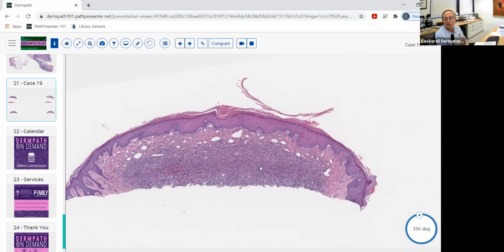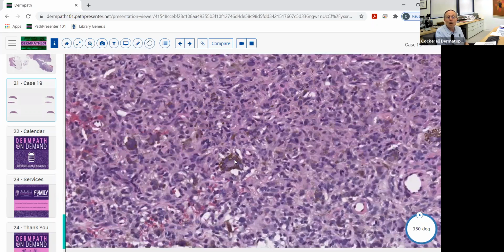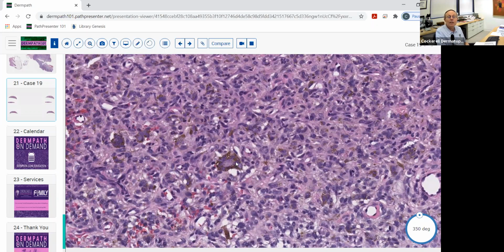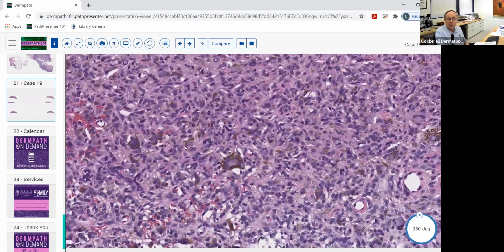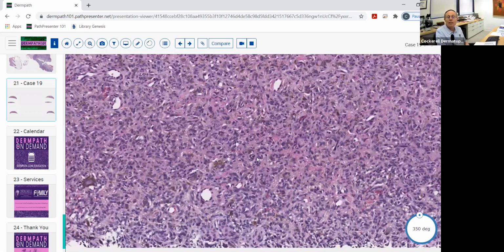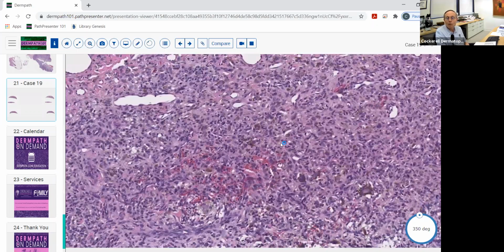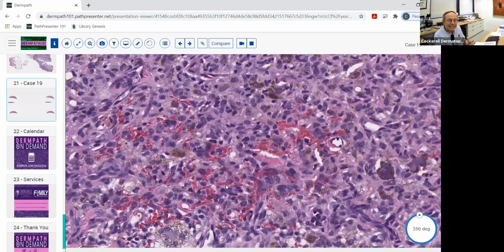And then we've looked at this type right here, which is what's called a cellular dermatofibroma with extravasated erythrocytes, kind of an aneurysmal fibrous histiocytoma variant of dermatofibroma. And again, these lesions give you a lot of extravasated erythrocytes, and they can give you these large angulated histiocytes that have engulfed hemosiderin. So lots of siderophages, lots of extravasated erythrocytes here. And so this is just another variant, if you will, of a cellular dermatofibroma that's got this angiomatous-like component to it. So it's basically a hemosiderotic aneurysmal fibrous histiocytoma variant of a dermatofibroma.